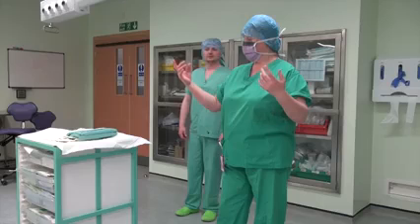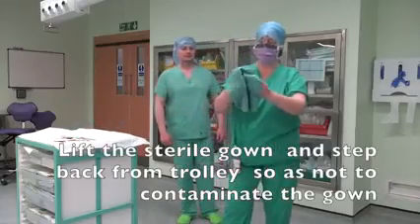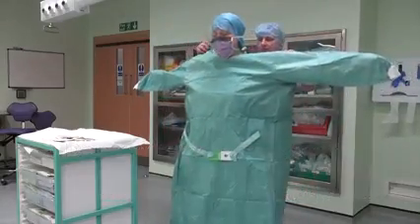Gowning and Gloving. Lift the sterile gown and step back from the trolley so as not to contaminate the gown. Don the gown by placing hands in sleeves, taking care not to contaminate hands and arms.